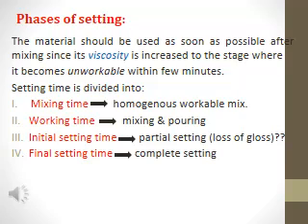At the initial setting, the material is hard but not strong enough, so you cannot remove the model from the impression. The final setting time is reached within several hours. The material is completely set and has sufficient strength and hardness. It takes several hours.